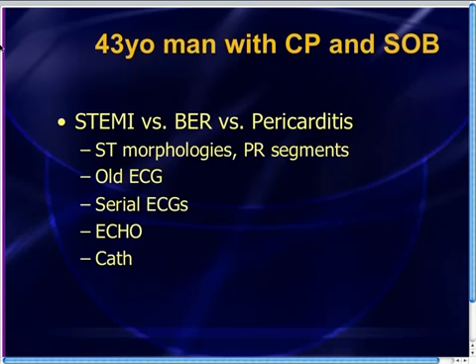In this particular case, serial EKGs did not help at all. So that's not helping. Pericarditis is not going to change. STEMI often will, but not necessarily. So if your serial EKGs are not changing, well, you still don't have an answer.